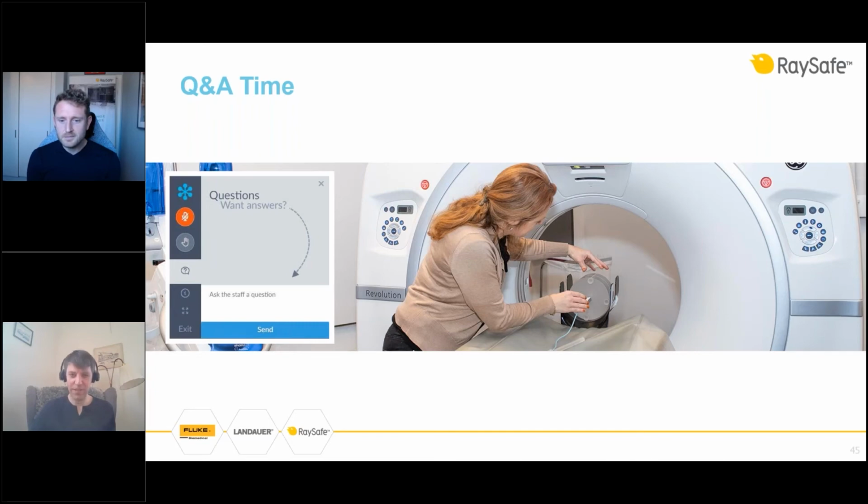Yes, I actually have some props here, so I think I'll make use of them. Here you have what many of you probably are familiar with, the X2 RF sensor. The X2 RF sensor only measures radiation that comes from above. It's shielded from below. You can see that I actually have one with the cover off. You see there's a little shield box here.